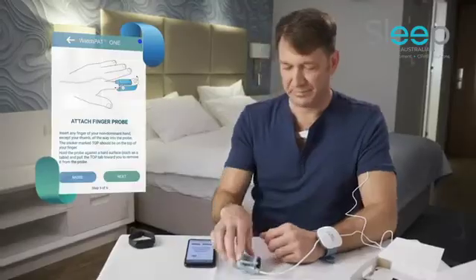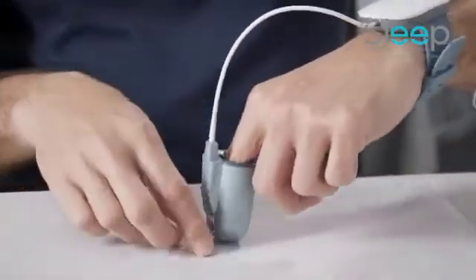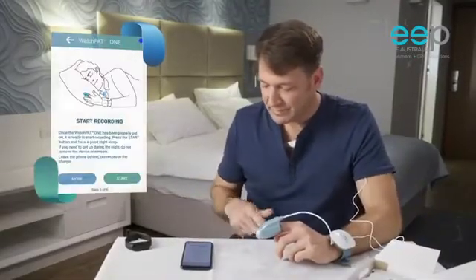Then place the index finger of your non-dominant hand inside the finger probe. While pushing it against a hard surface, pull out the tab. Be careful not to twist the probe, then press next.